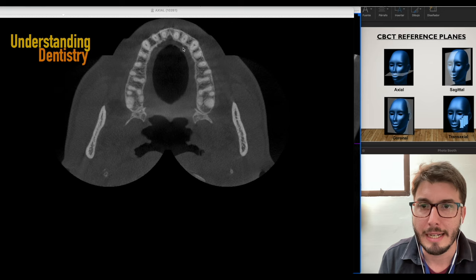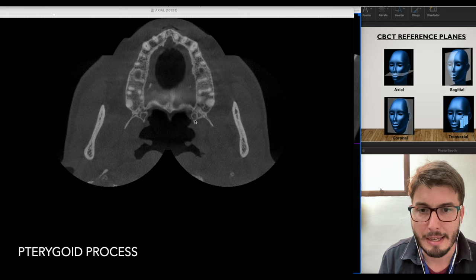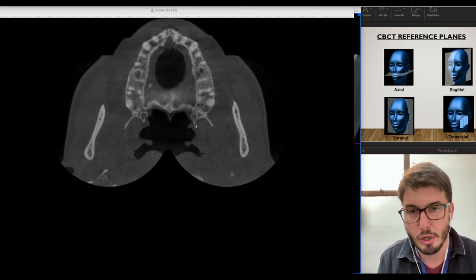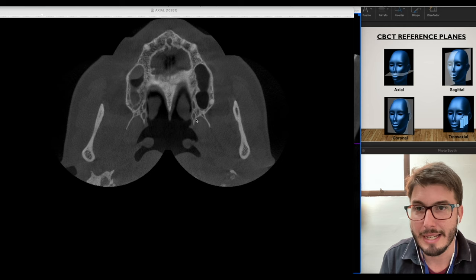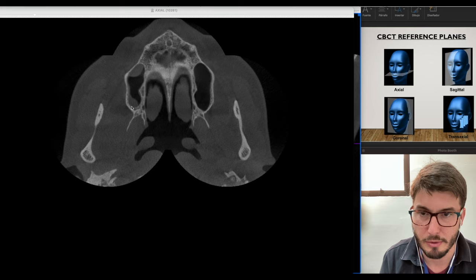After the tuberosity of the maxilla, we are seeing the lateral plate of the pterygoid process and the medial plate of the pterygoid process. The pterygoid process belongs to the sphenoid bone, and the medial plate has the hook-shaped structure which is the pterygoid hamulus. Continuing upwards, we're now seeing the maxillary sinus, the nasal cavity, and the nasal conchae. I'm already seeing some hyperdensities in the maxillary sinus — sinus opacification — which we'll check in the other planes.